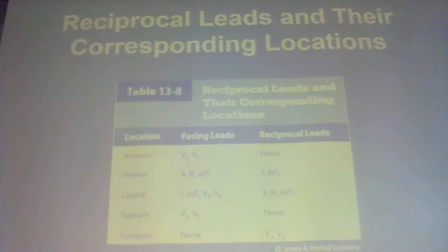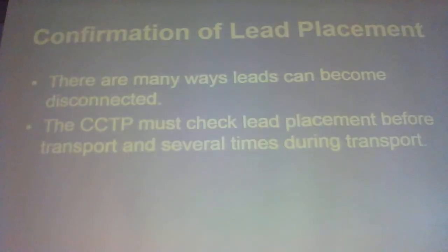So anytime you have somebody that looks, acts, and smells like a STEMI, has some depression in the anterior leads, you need to go on the back and look. Because what did we say? 90% of people are right dominant. That makes sense? Huge. All right.